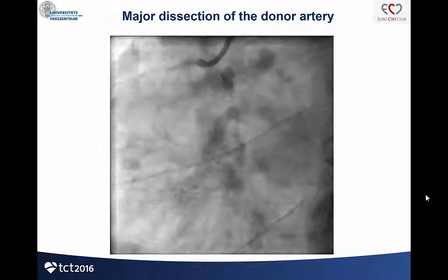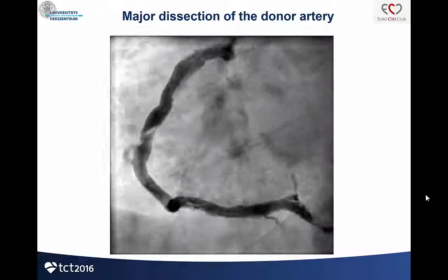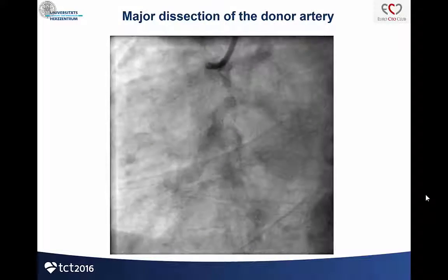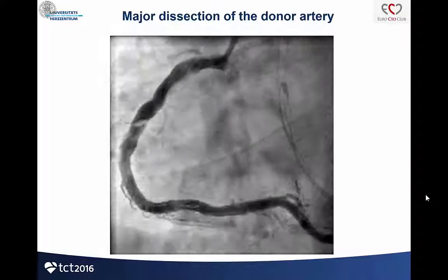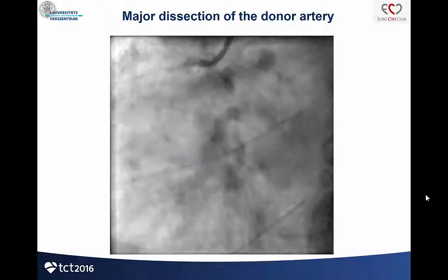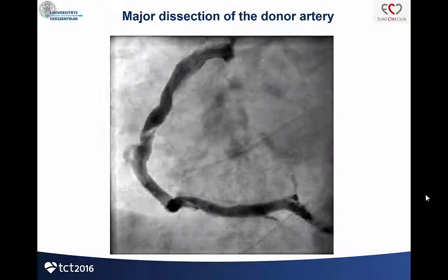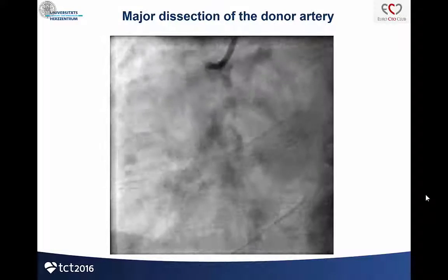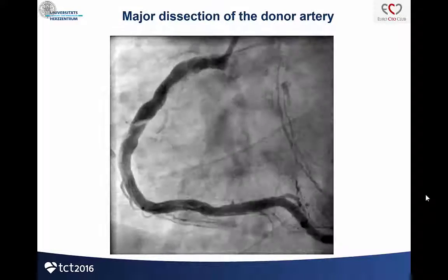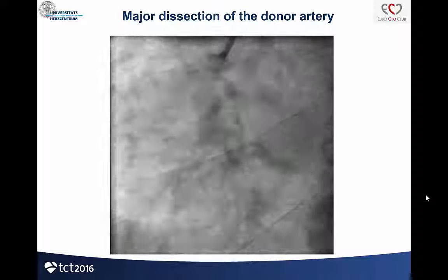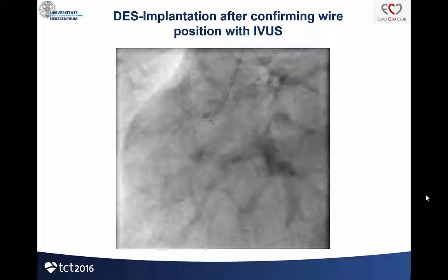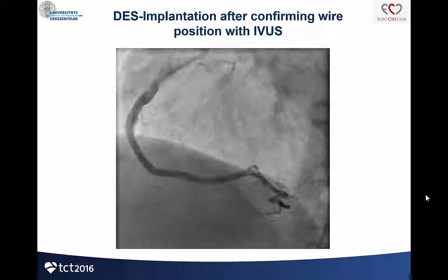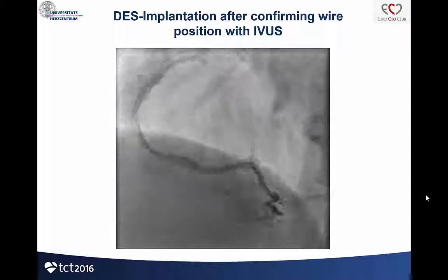Then I did the next angio and saw a huge spiral dissection. The problem was that we also had septal collaterals to the LAD, so the patient was not doing well. The first thing I did was knuckle down the guidewire and hoped I was in. I confirmed with IVUS and was lucky to be in the true lumen, so I had to stent the whole vessel.